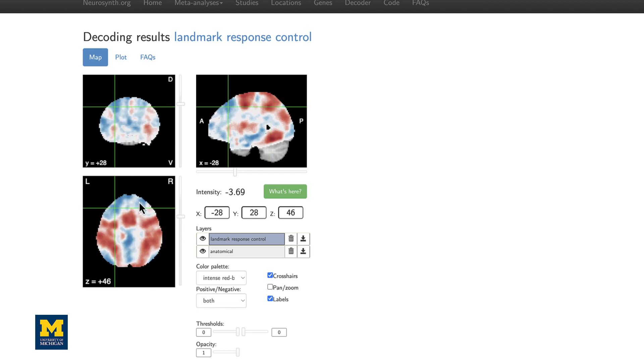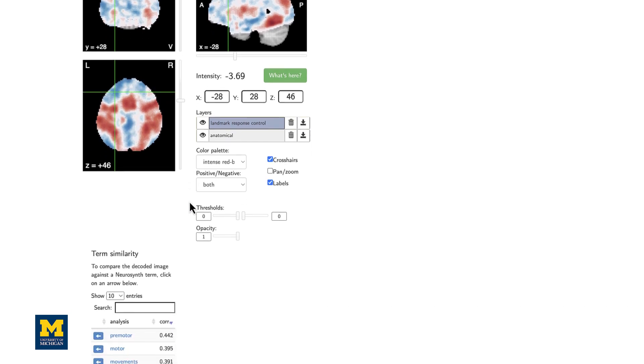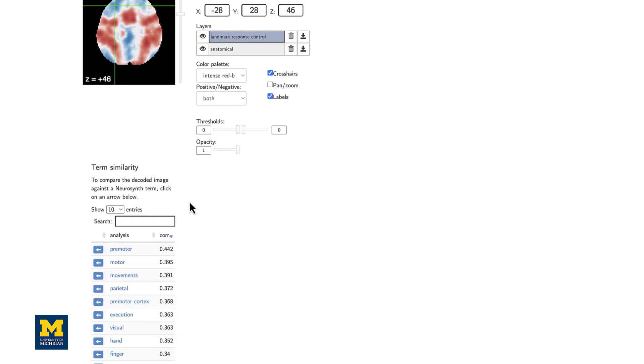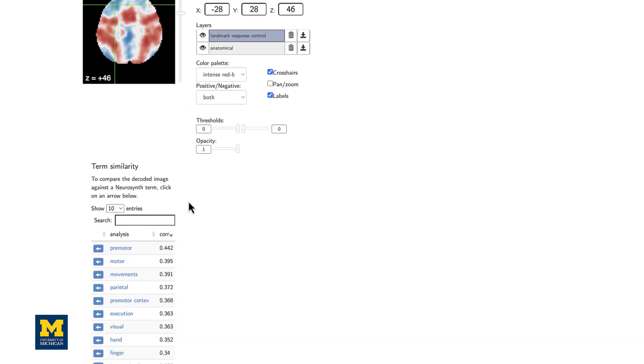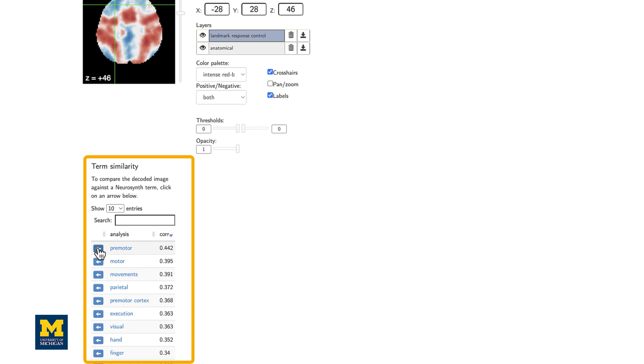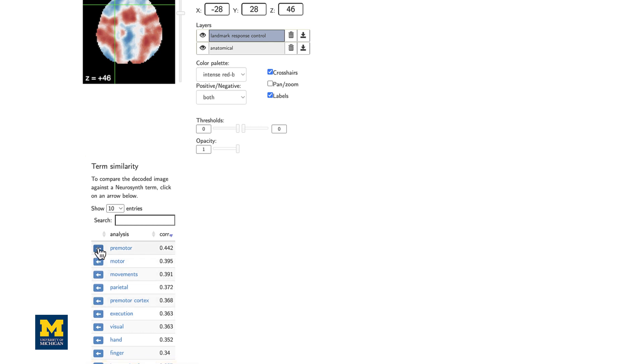And some decreases in activity in places like the lateral prefrontal cortex. If you scroll down, you'll see a list of term similarities or the amount of correlation of different meta-analysis maps in the Neurosynth database, such as different cortical areas, premotor and motor, and different conceptual terms such as execution.